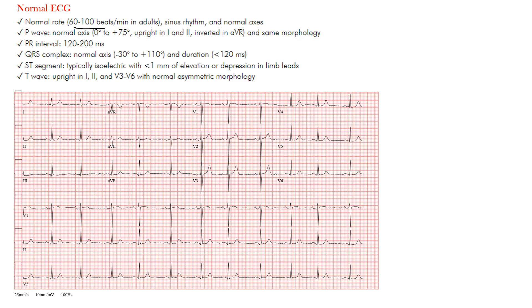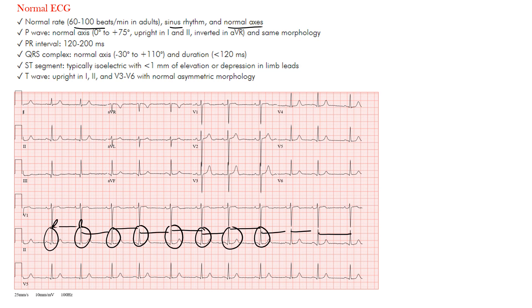The normal rhythm is sinus and the normal axis we'll discuss will follow. Looking here, we have a regular rhythm — notice our R-to-R intervals are all the same throughout. The rate can be found by counting our QRS complexes: one, two, three, four, five, six, seven, eight, nine, ten, eleven. So you'd do eleven times six — the rate is around 66, within normal limits, maybe a little faster around 70 or so, but within normal limits.